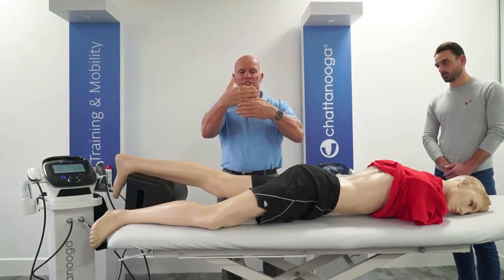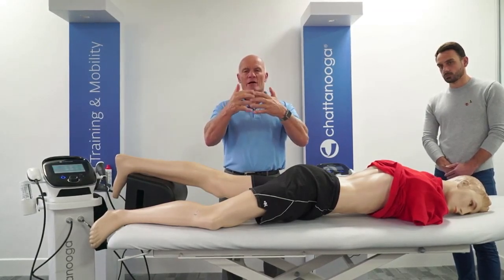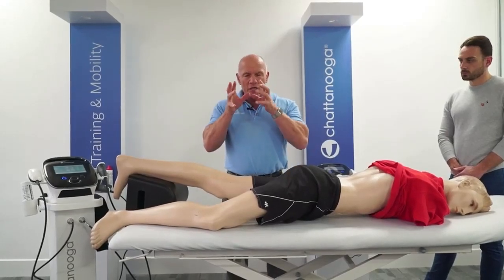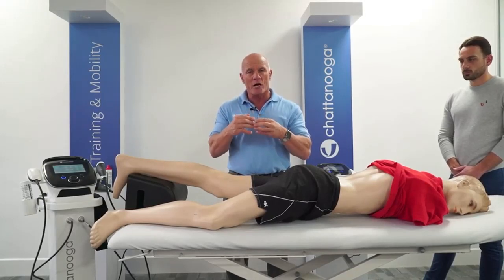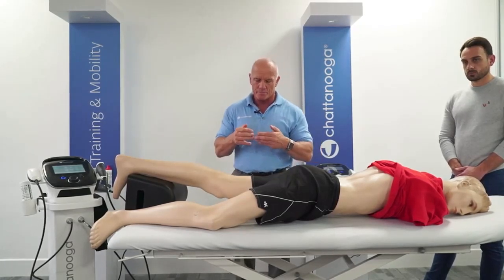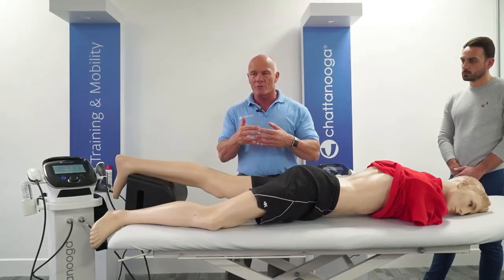So this is very good where you've got locked up tissue and you want to force it apart to allow oxygenated blood to get to the area. Things like myofascial trigger points. Now we're going to have a look at this a bit later, but the low frequency sonic component has been shown and demonstrated to have more depth of penetration, therapeutic penetration. So it's this component which is being argued to have the most value in radial pressure wave therapy.